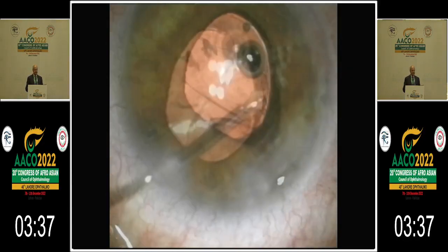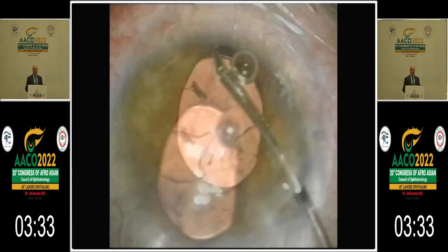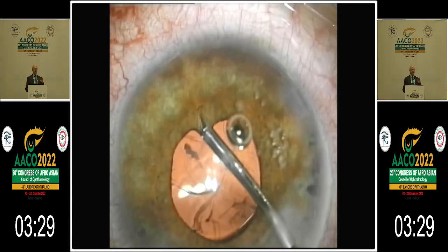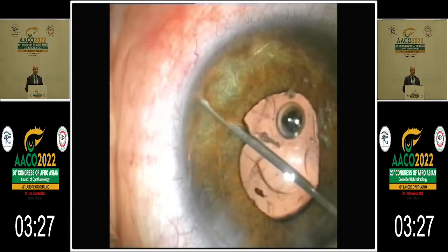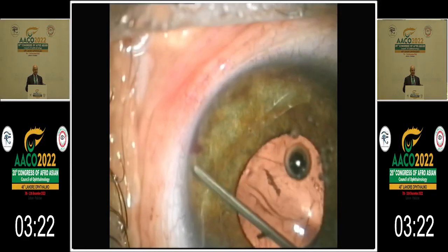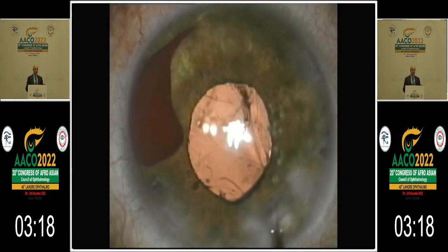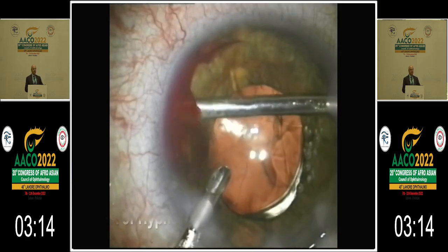With this stretching, sometimes you can induce some bleeding from the angle, the root of the iris. If this happens, just stop and increase the pressure inside the eye. And this is viscosynechialysis again, now with less volume because of the removal of the lens. And of course, if you have a direct gonio lens, you can do it under vision.